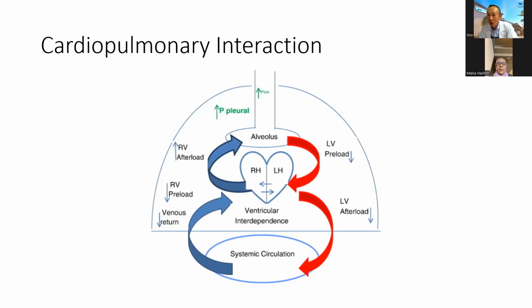If you ask me honestly, have I treated a Glenn shunt with ARDS or not? Well, probably not. So I can tell you the theory behind doing it. If I were to have this patient, yes, I will try to make sure the lungs are as open as possible, but without too much pressure. So things like HFOV might be useful, as you do not use the maximum pressure that you can apply.